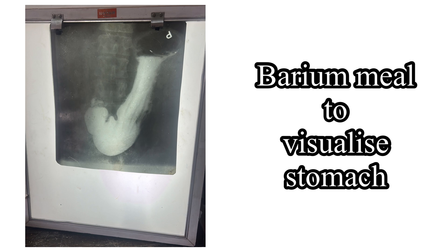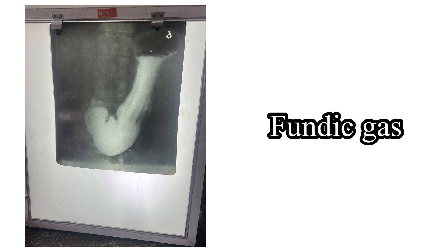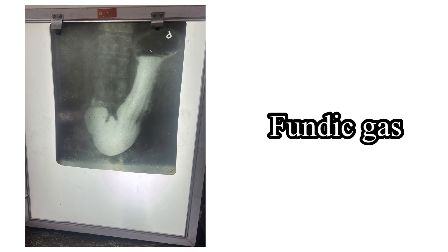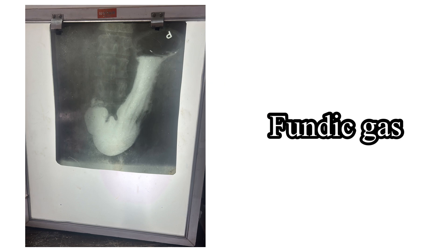This is another X-ray done with the help of barium meal, in which the stomach is prominently visible. There is a large air bubble in the fundus of the stomach, which is seen as a dark shadow.